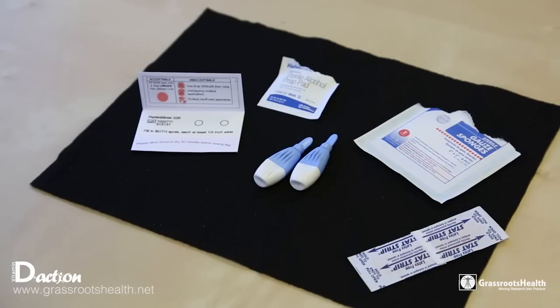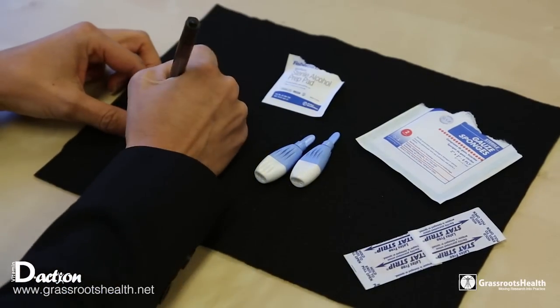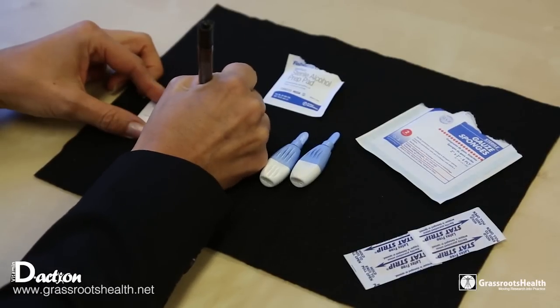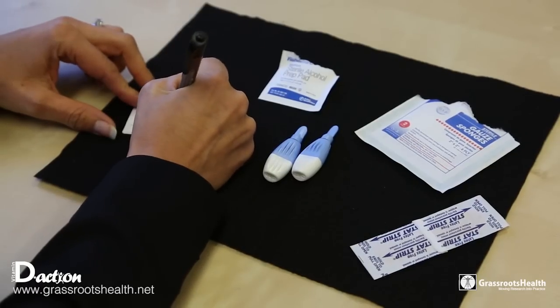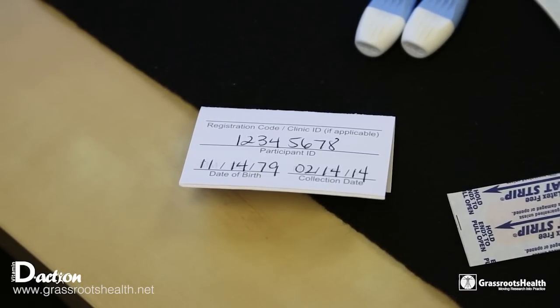Pick up the blood spot card and on the back of the blood spot card, write in your participant ID, which you get from logging into your account, the date of birth, and the date of collection. And that's all you need to do with that.